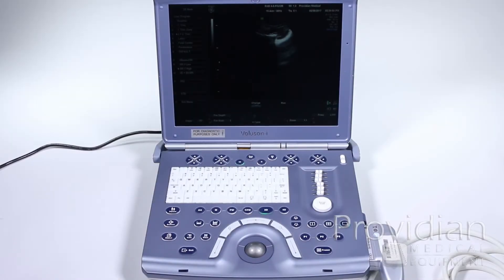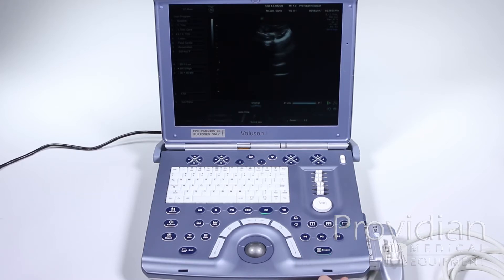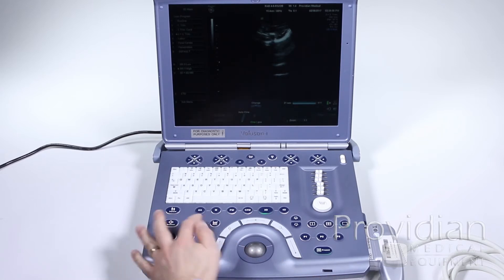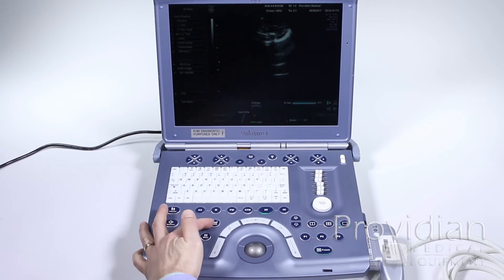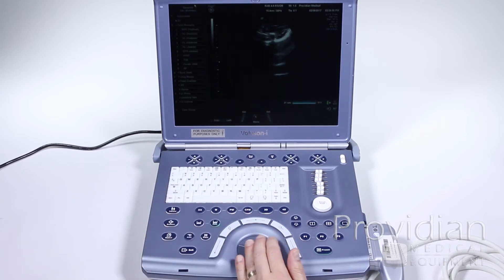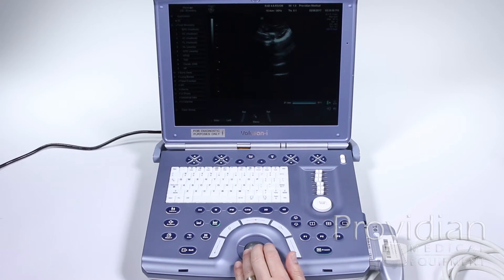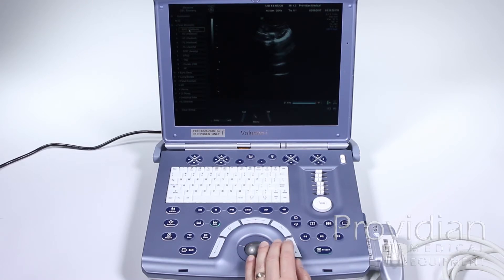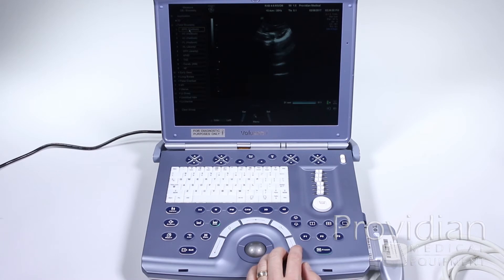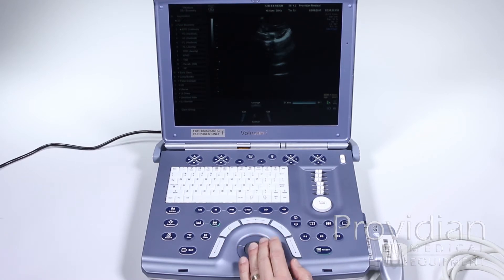We'll start with making 2D measurements. Start by pressing the freeze key, then press the calc button to push it down and we can take our measurements. I am setting an OB measurement right now, so it immediately went to the OB biometry measurements here, which is the default.